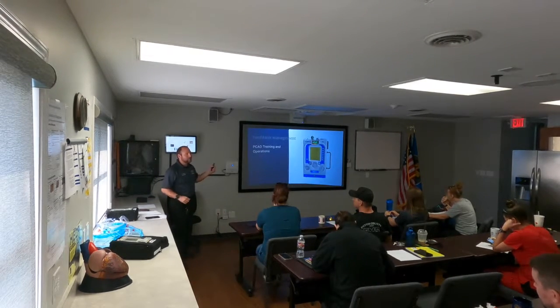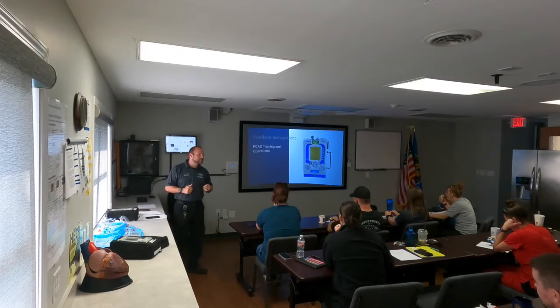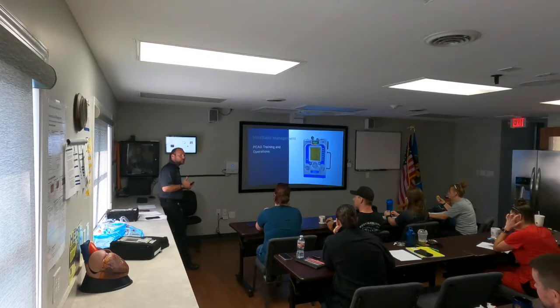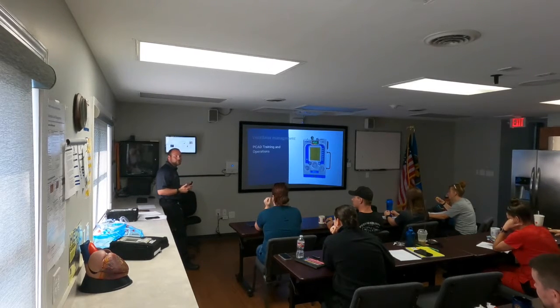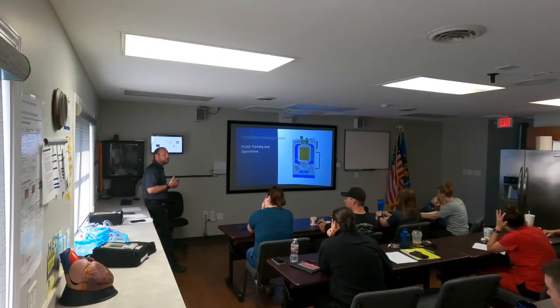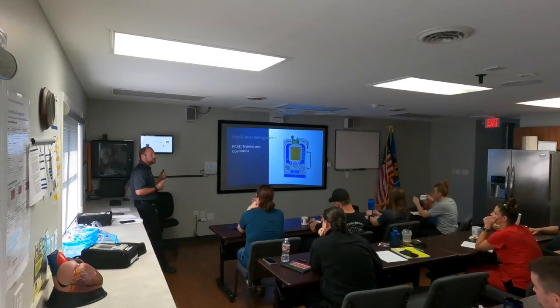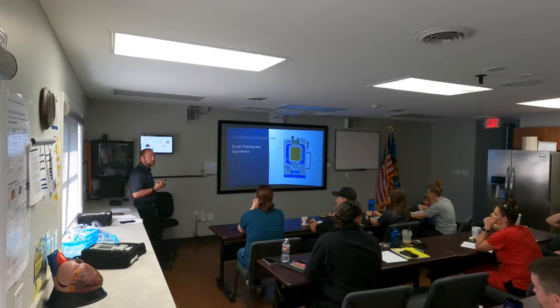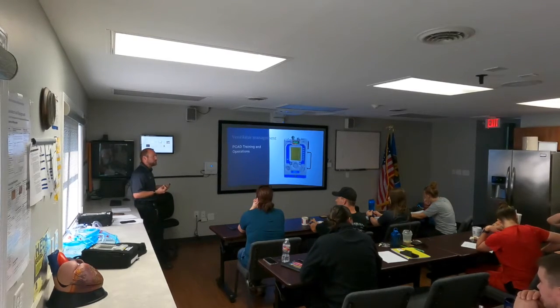So we're just going to get right into it, ventilator management. What we're going to be going over in this course is the basic modes we have, the differences between pressure and volume control. The focus I really want is that overall we don't have issues knowing the difference between AC and SIMV, or why we're using targeted volume versus targeted pressure. It's more in the aspect of our non-invasive modes that we seem to need the most troubleshooting with.